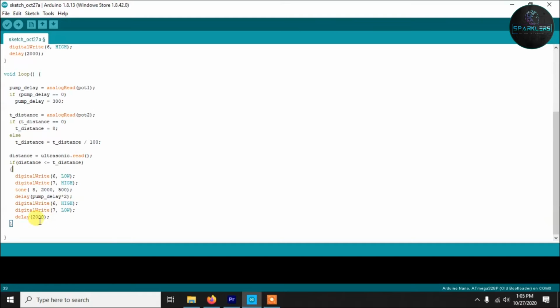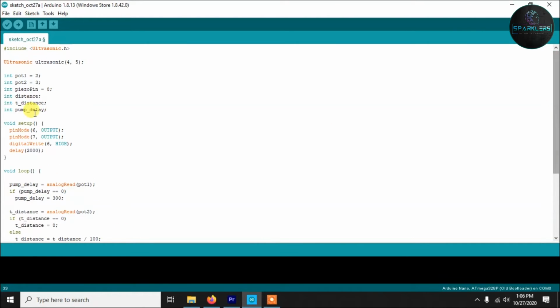And finally, we are giving it a 2 second delay. This is because after someone takes the sanitizer, this device will wait for 2 seconds, and only after that can another person take the sanitizer. This is just to stop the waste of sanitizer. But again, these things you can delete. So this is how the code looks. Again, you can modify it as you need. Now let's upload this code, and let's see how it looks at the end.